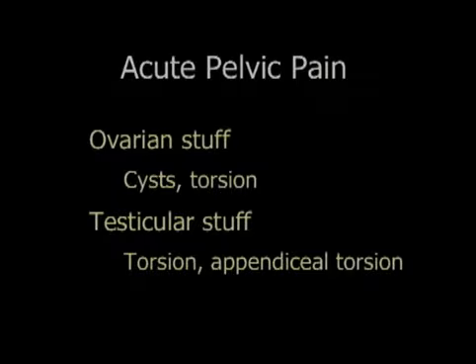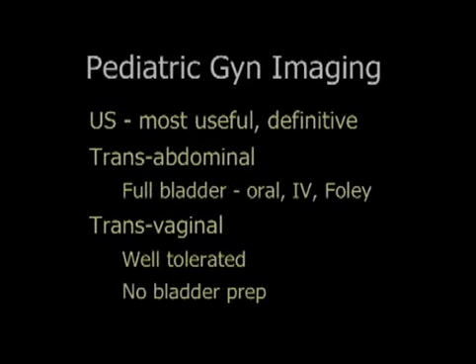So let's talk about acute pelvic pain. So basically that'll be ovarian issues in girls and testicular issues in boys. Not surprising, ultrasound really is the most useful modality for pediatric gynecologic imaging.